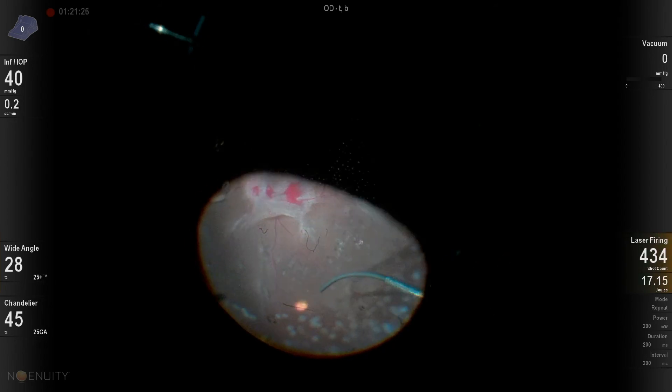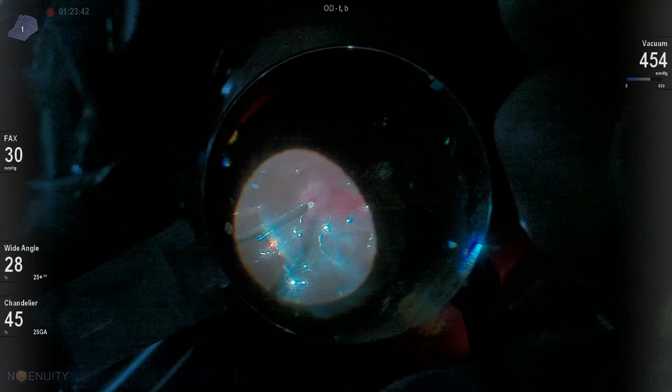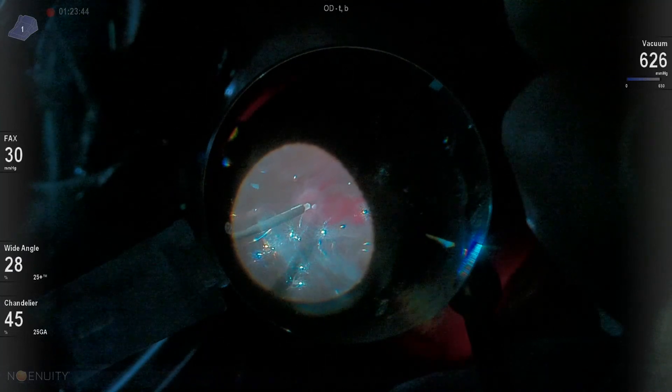Always applying PRP laser treatment. And I always like to leave these patients under gas or air — it helps with wound closure, helps that retina that's all folded up to perhaps unfurl and look more natural, and decreases the potential for hemorrhage to recur. Thank you again for watching.